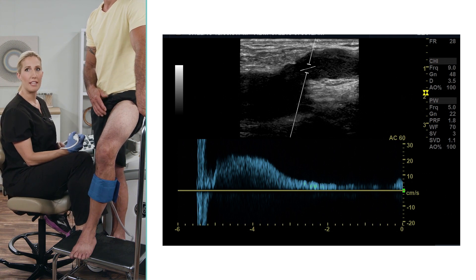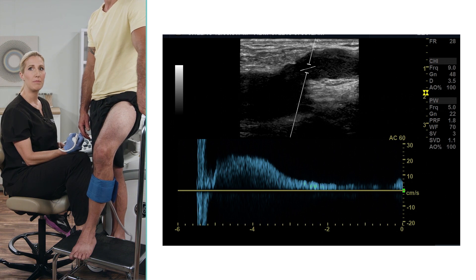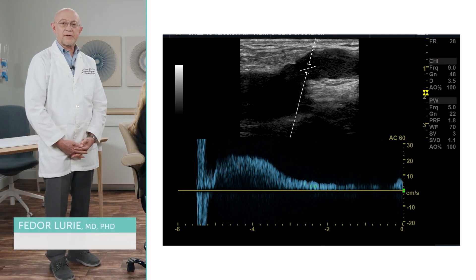What a beautiful waveform at this level. Clearly, we can see that this vein is incompetent. Your thoughts, Dr. Laurie? I think you are correct, Julie.